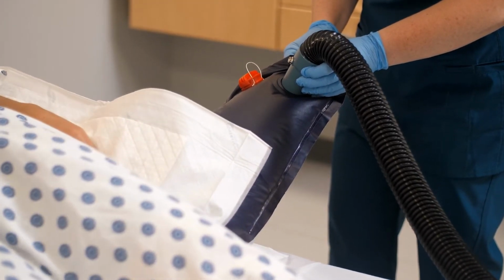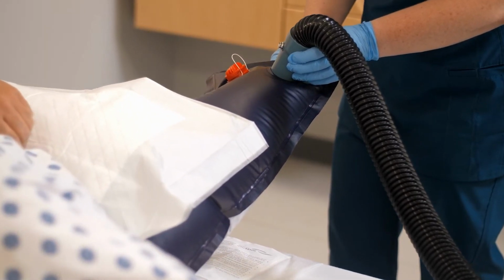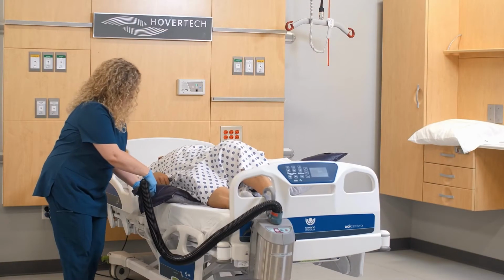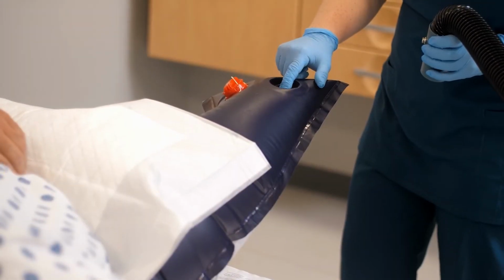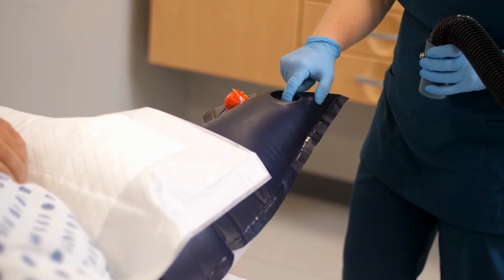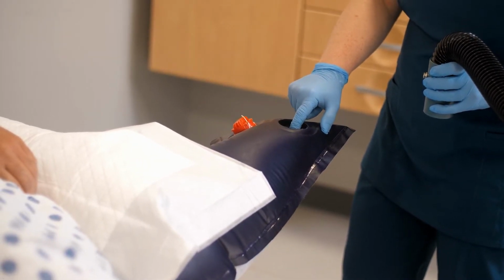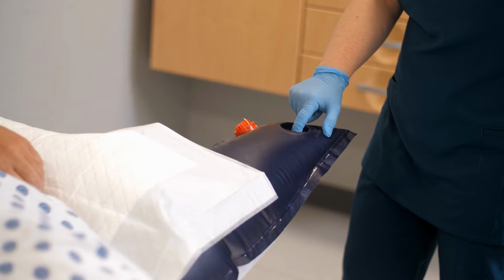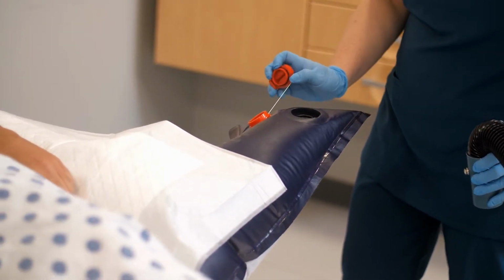If turning to offload pressure, inflate until a 30-degree angle is achieved. Slightly inflate the other chamber just enough to reduce the pressure from the patient lying on their side. The black valve has a flap that can be depressed to slowly release air from the chamber. This adjustability allows for small amounts of air to be released for patient comfort and to provide microturns. For emergencies, the red valve can be opened to quickly deflate the device.